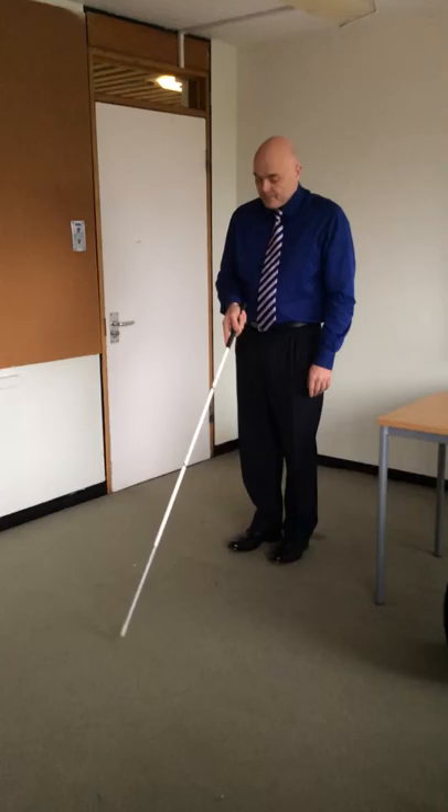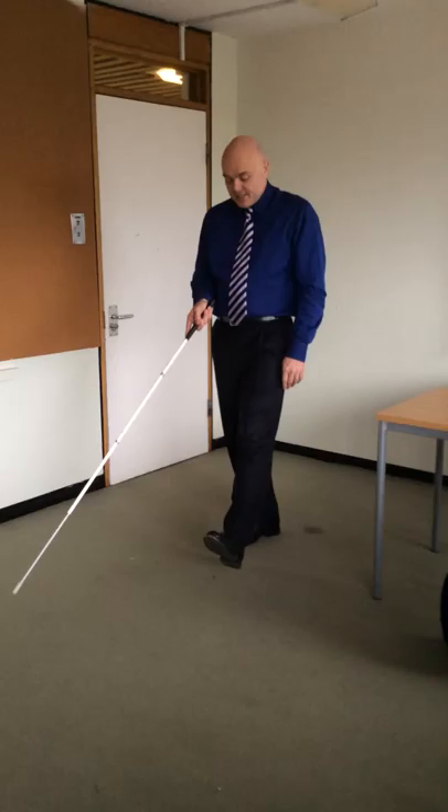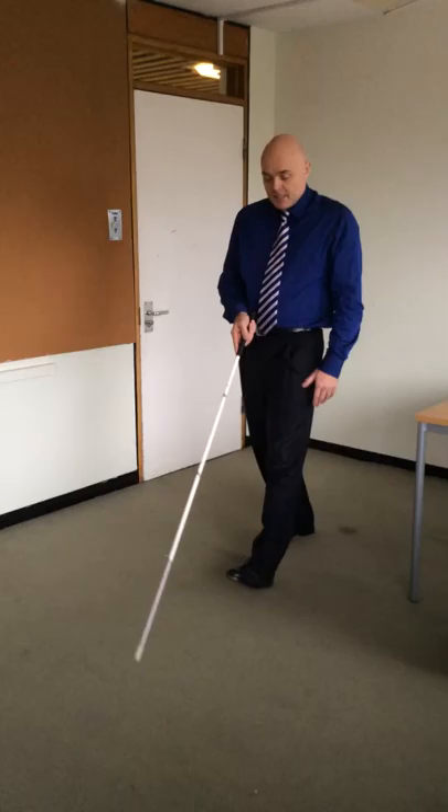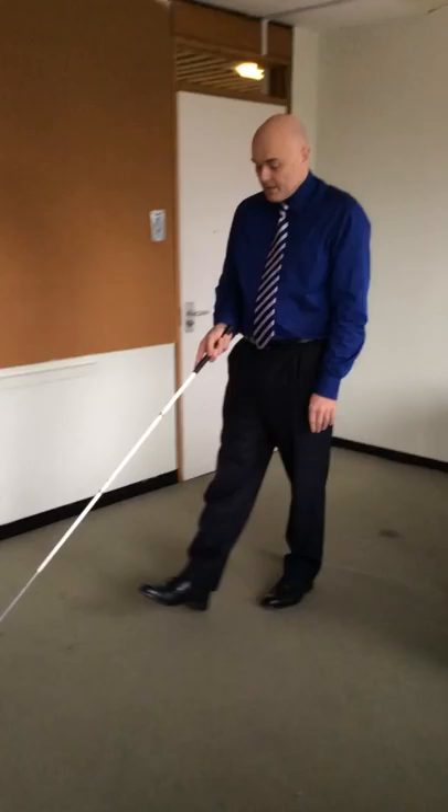When walking with a cane, two-point touch: the cane tip touches on the right-hand side as the left foot heel hits the floor on the left-hand side, and vice versa. If we're walking out of step, the cane tip will be touching on the same side as the foot touches. So as the left foot comes forward, the cane tip touches on the left — this is out of step.